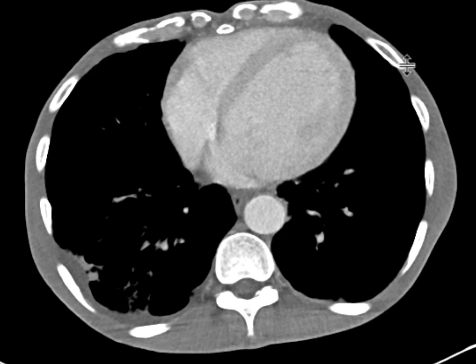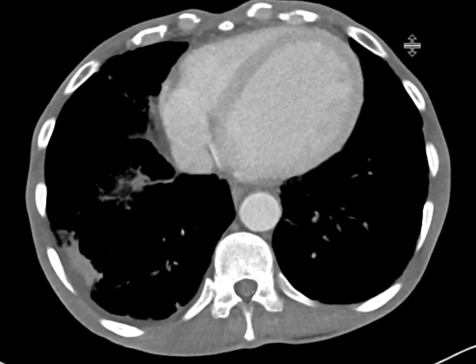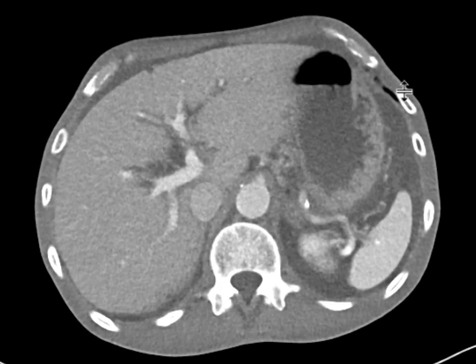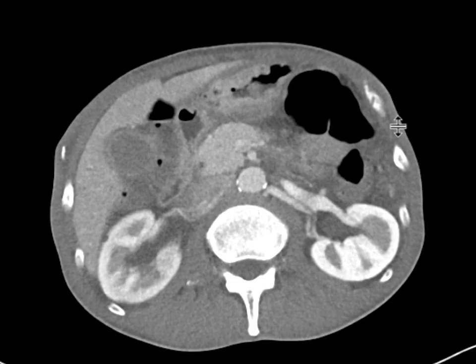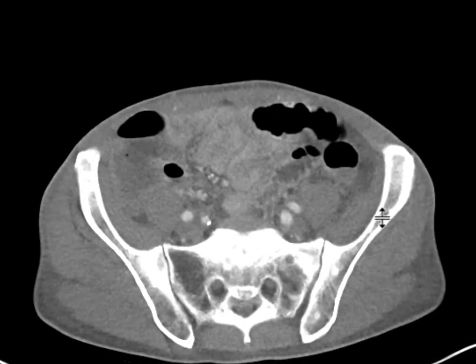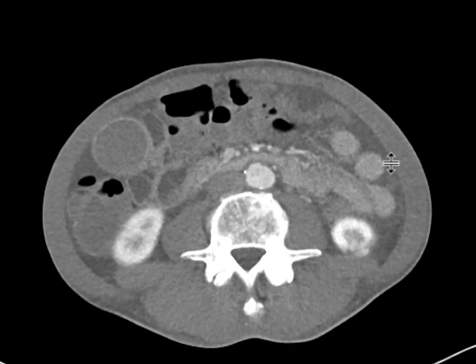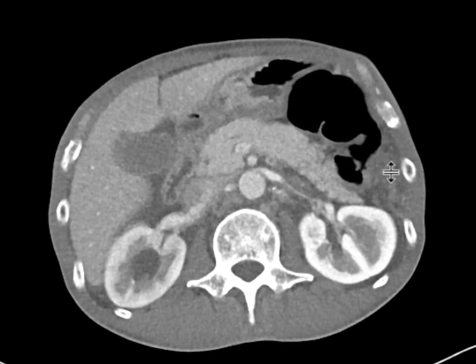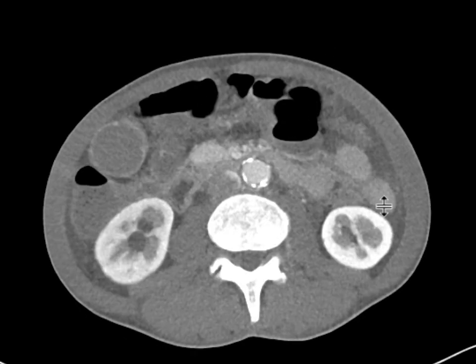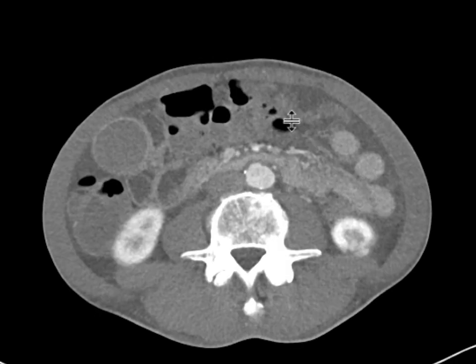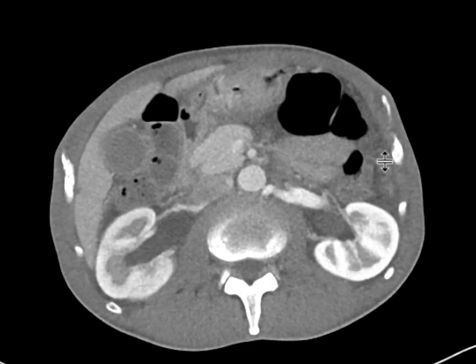This patient comes in with epigastric pain and diarrhea. We get a CT scan with intravenous contrast and there's a whole bunch of things going on here. One of the first things we can notice is that there's quite a bit of ascites within the abdomen and pelvis. As we look closely within the omentum, we can start to see separation of some of the bowel loops, and in the abdominal wall there is increased soft tissue extending all the way out over here.